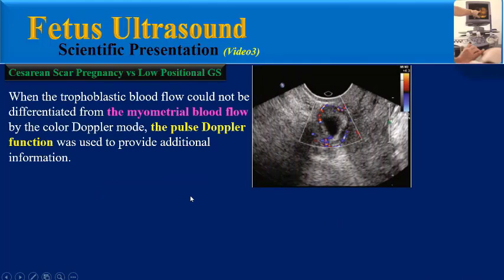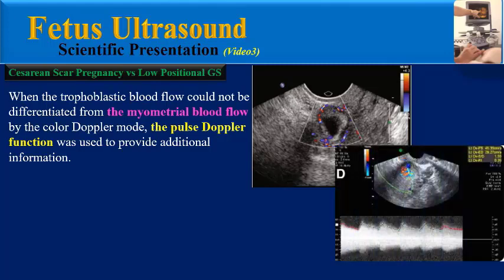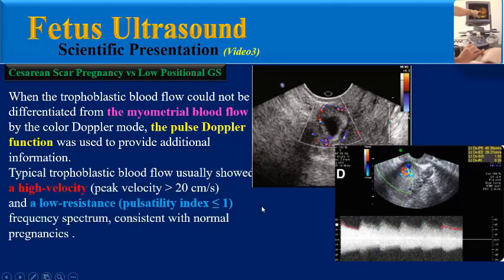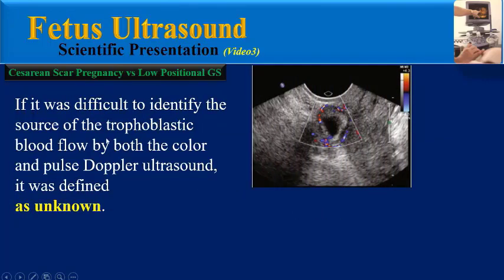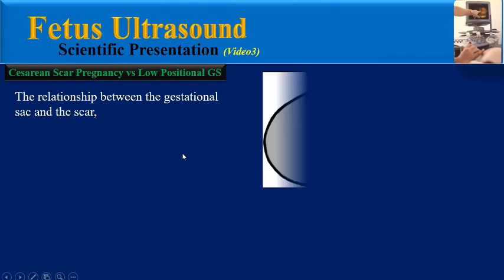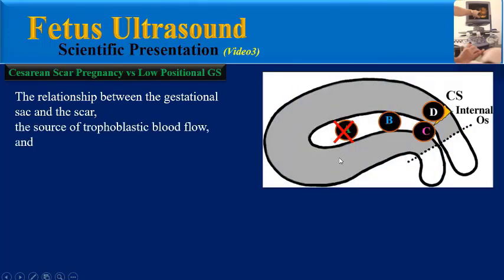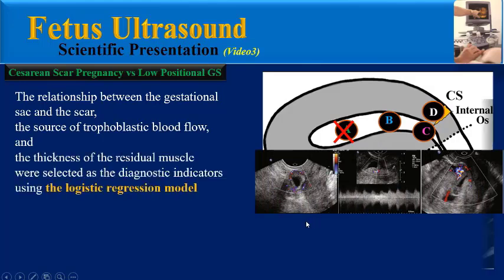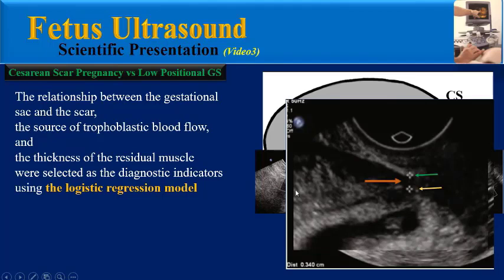When the trophoblastic blood flow could not be differentiated from the myometrial blood flow by color Doppler mode, the pulse Doppler function was used to provide additional information. Typical trophoblastic blood flow usually shows a high velocity and low resistance frequency spectrum, consistent with normal pregnancies. If it was still difficult to identify the source of trophoblastic blood flow by both color and pulse Doppler ultrasound, it was defined as unknown. The relationship between the gestational sac and the scar, the source of the trophoblastic blood flow, and the thickness of residual muscle were selected as diagnostic indicators using the logistic regression model.